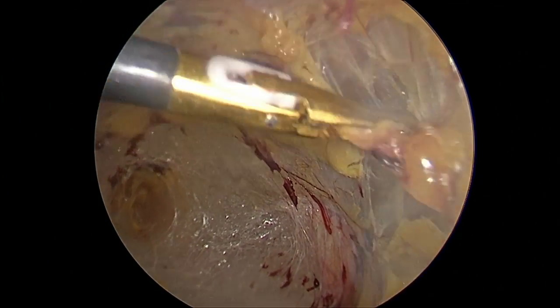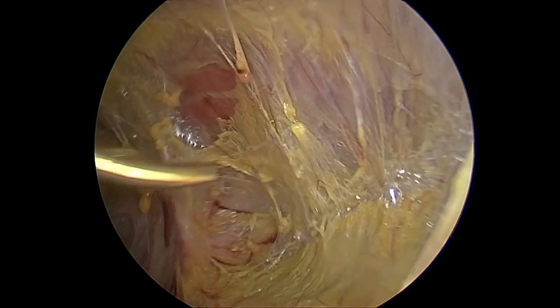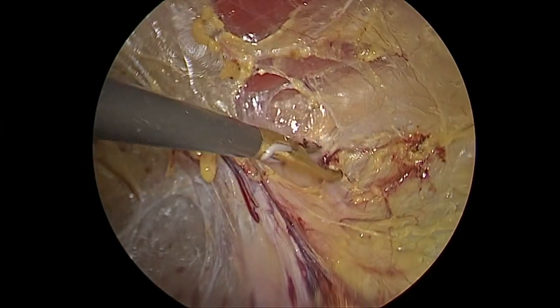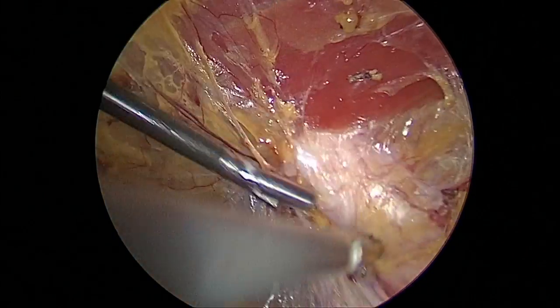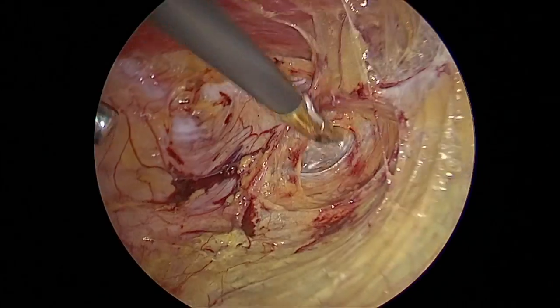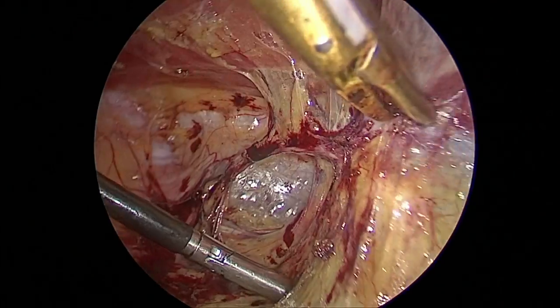I am dissecting the eTEP space, and here I am taking a cut on the medial part of the left arcuate line. Dissecting, we are reaching the hernia. I have put in another port, and what we are seeing here is actually the PRS on the right side. However, I did not realize that, and I separated and I reached the Bogros space laterally.